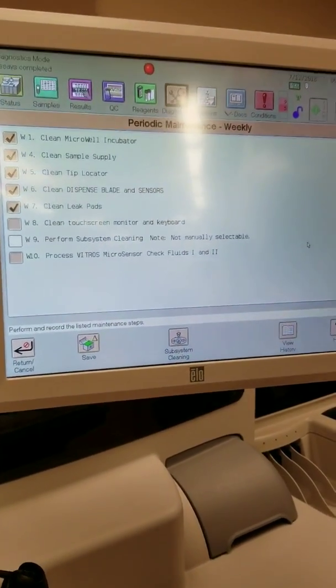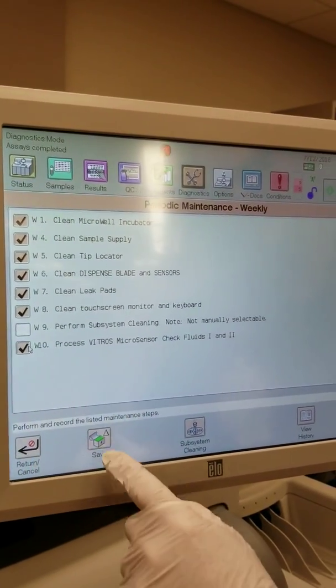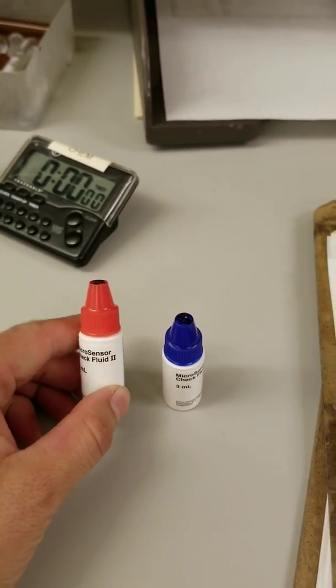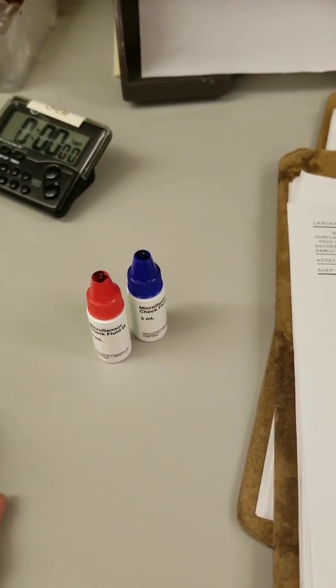Now all that's left is to clean the touch screen monitor and keyboard and process the Vitros microsensor check fluids. Lastly, we would run the check fluids, but that actually has to do with QC so it won't be covered here.